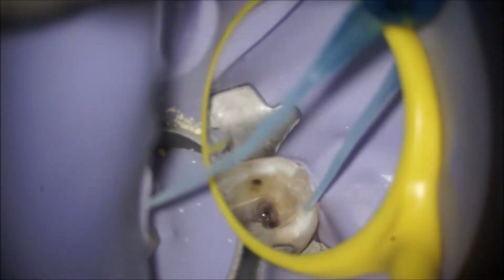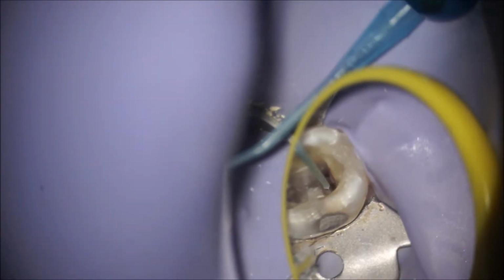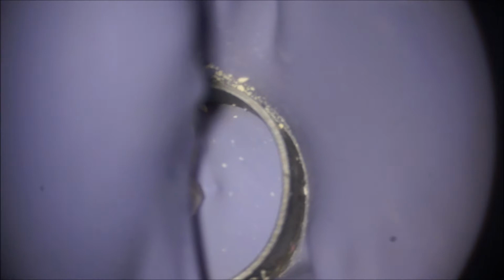I actually think sandblasting might have worked better to clear the lesion out, but getting the aluminium oxide out afterwards may also prove a bit of a challenge. Ultrasonic activation worked well to get the last of the dentin chips out as well.